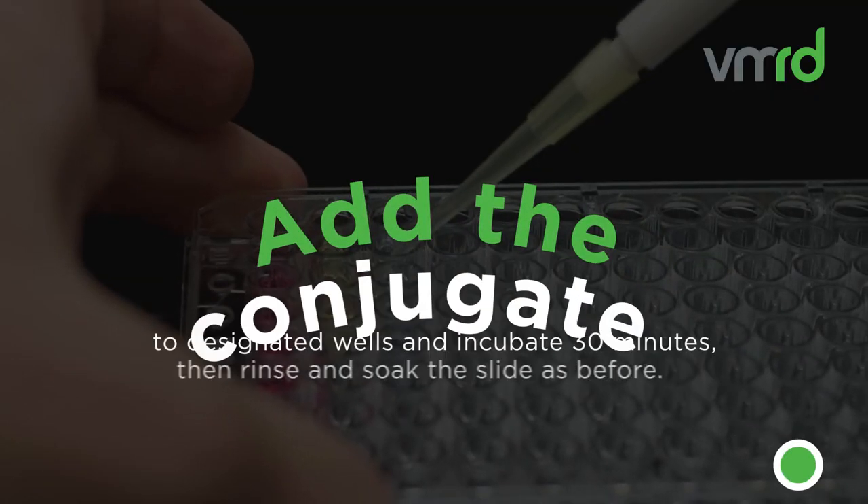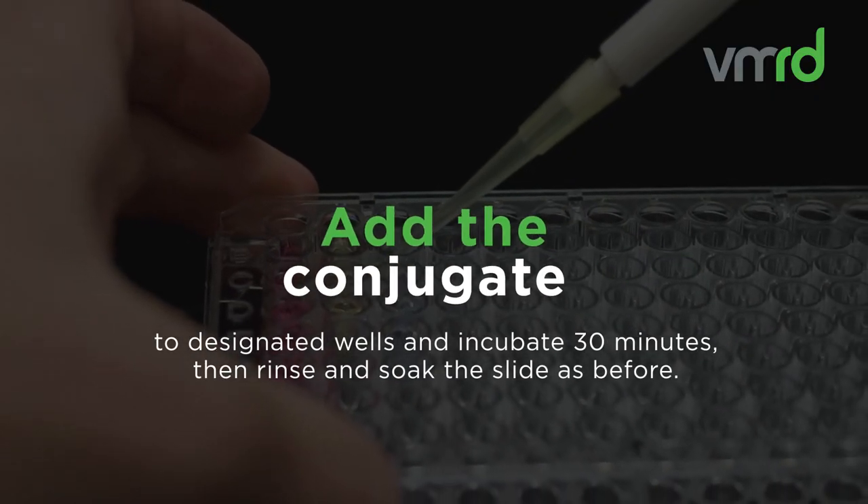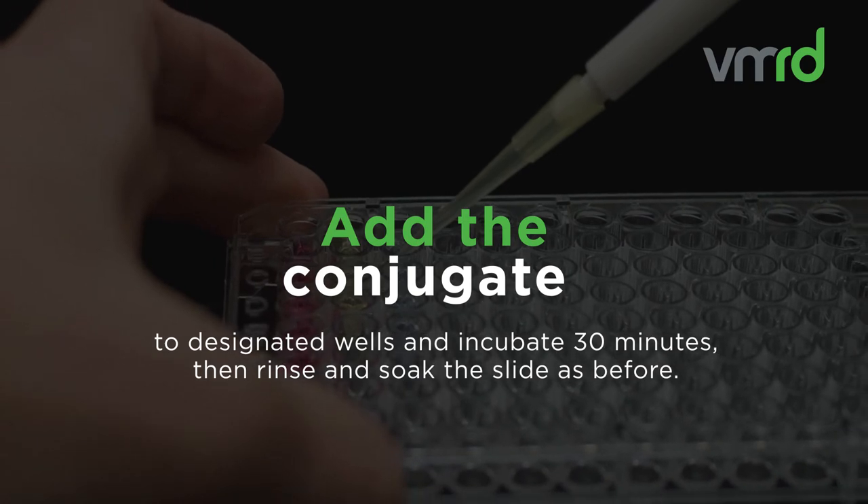Add the conjugate to designated wells and incubate for 30 minutes. Then rinse and soak the slide as before.